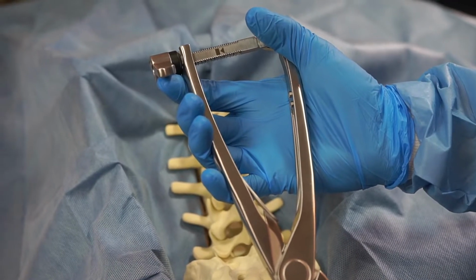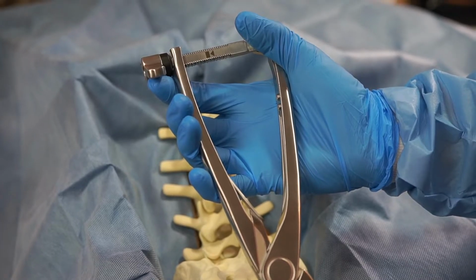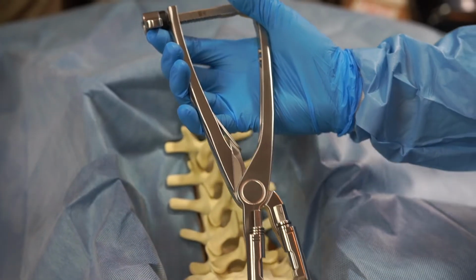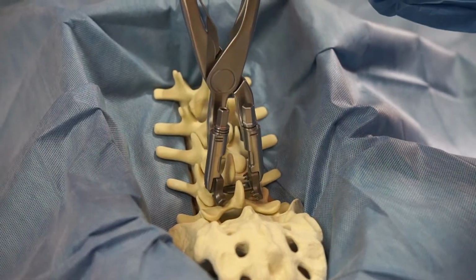If the surgeon has elected to remove the interspinous ligament, the implant can be placed with the PG inserter compressor assembled as shown here. If the tips of the spinous processes are too close, you can simply rotate the implant into position as shown here.